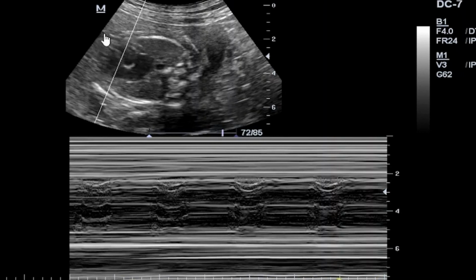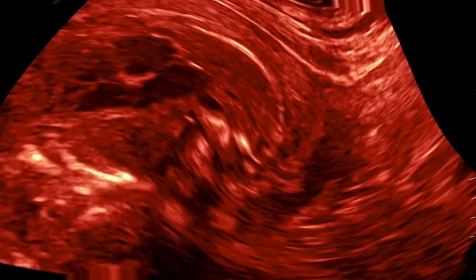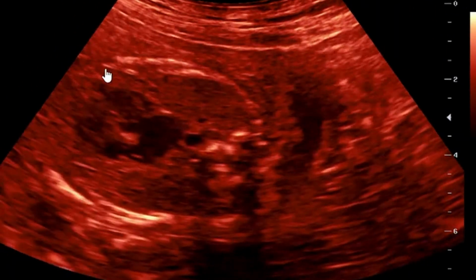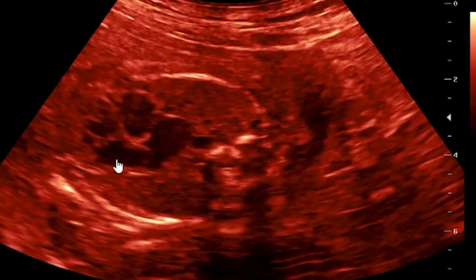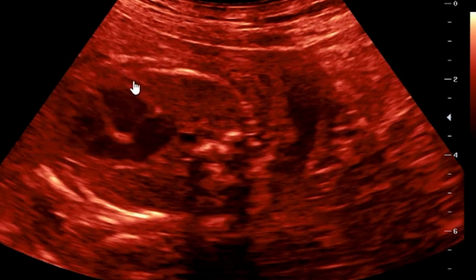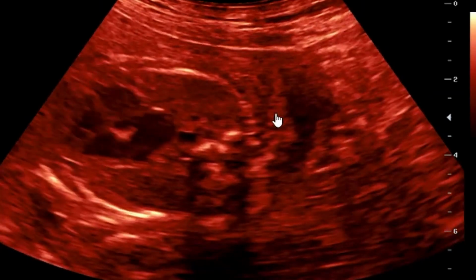The heart is extending outside the thoracic cavity, forming a pouch that we can see here. So this is Ectopia Cordis. Again, on this tint map, you can see that the heart is actually beating slowly here, and it's extending outside the thoracic cavity, a condition which we refer to as Ectopia Cordis. Ectopia Cordis generally means a heart at an ectopic site. I hope you're appreciating what I'm talking about.